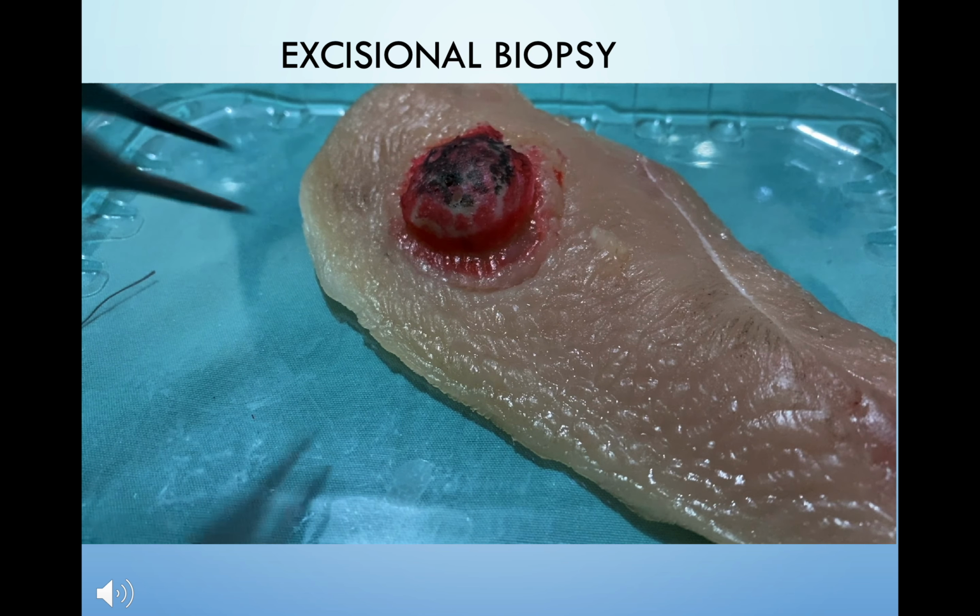In this video, I'm showing how a suture is made at the margin. Okay, you can choose to use a simple interrupted suture, or you can make a loop to indicate different margins. Sometimes you can include 2 long sutures or 2 short sutures, or 1 long 1 short suture to indicate different margins if there are multiple margins in the specimen, especially in a big surgical specimen.